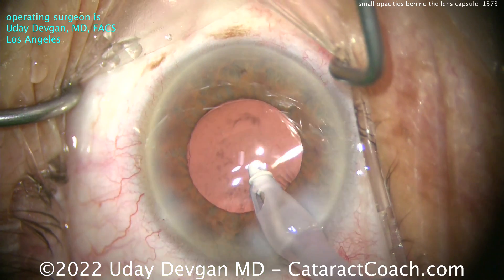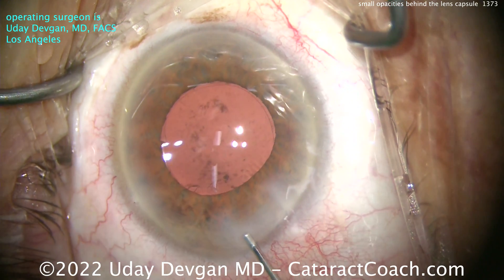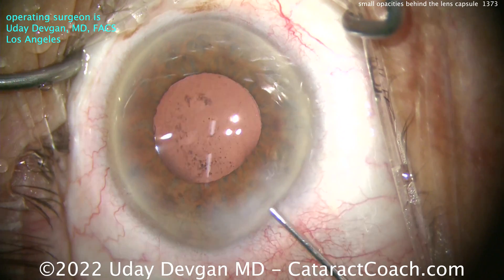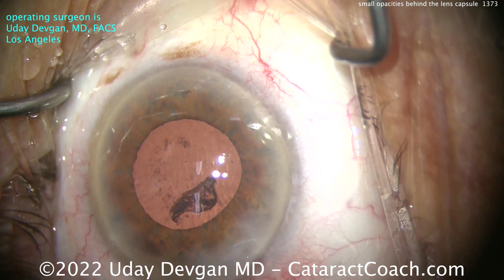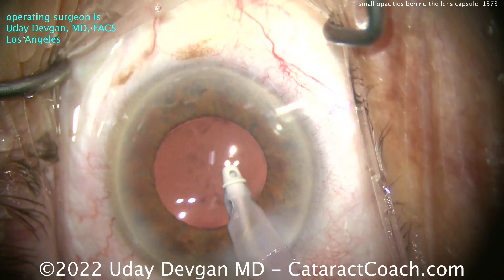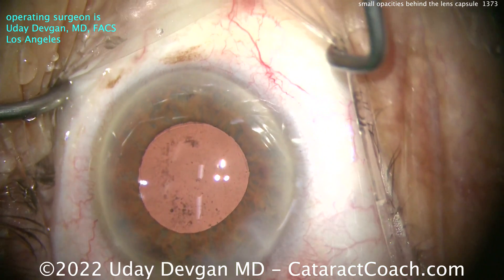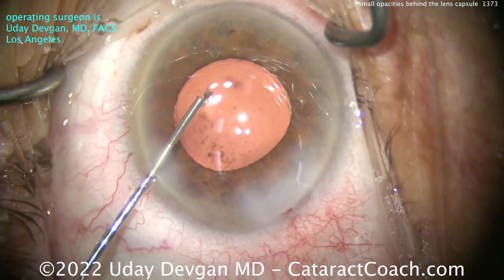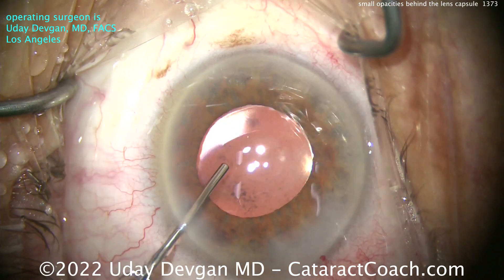There's really no clean way of getting those out, and I don't recommend it either, because they'll very easily resolve in the inflammatory cascade. Look at all those particles — it looks like a lot initially. But again, this is the variation in patient anatomy; every patient's got a little bit different anatomy — no two patients are identical. Hey, look at that surprise — maybe we should get that out. So under the iris, there was a little bit of lens material, a lens fragment. We just washed it out of the eye. That's also another reason why I like to do that sweep inside the eye — the angle sweep. You'll sometimes be surprised by what you may leave behind if you don't do that. Sealing up the incision the right way, a mild amount of hydration on the roof, and then the angle sweep again. The tiny lens material — those little pepper flakes — we're going to leave them alone.